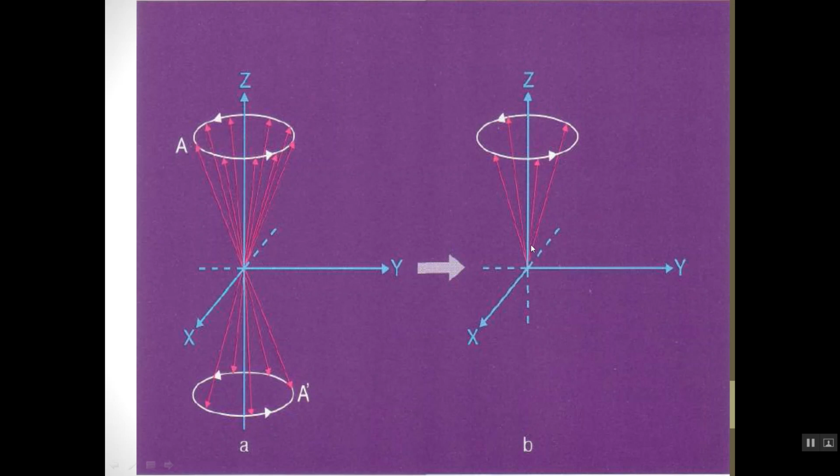It's impossible to discriminate between the two: the magnetization caused by the protons themselves and the magnetization caused by the main magnetic field. So if I want to detect the magnetization of the protons themselves, I have to do something to move these protons in another direction.